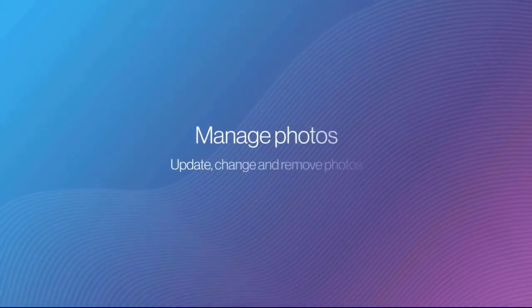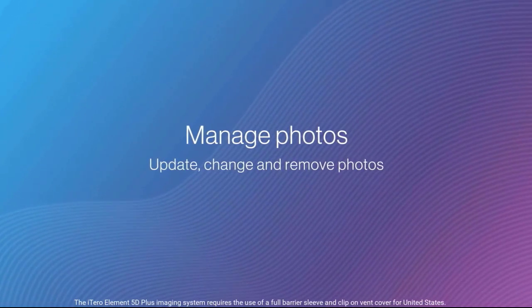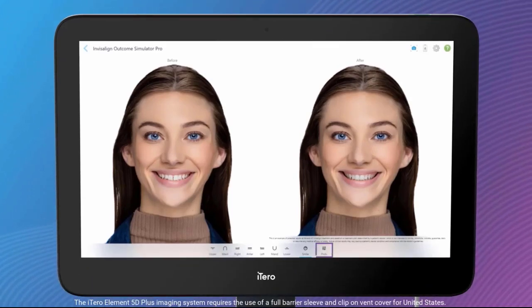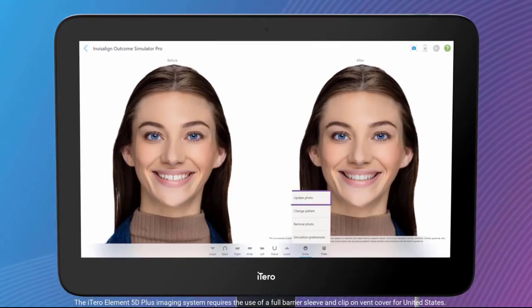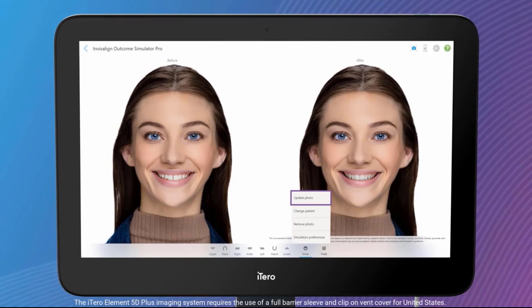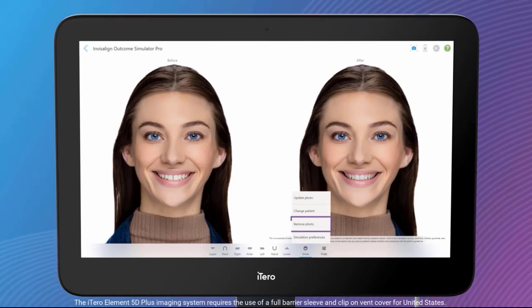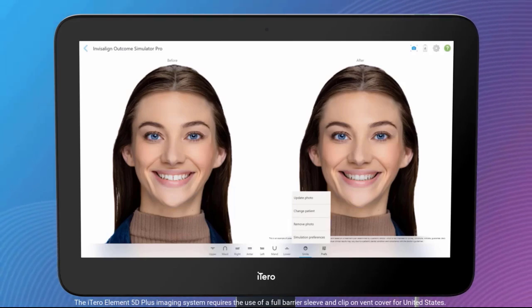Manage Photos: update, change, and remove photos. Tap the Preferences button to manage the patient photo. You can update the patient's photo to a new photo, change the photo to another patient, and remove the photo from the simulation if needed.